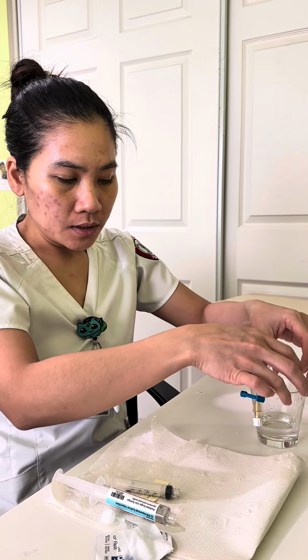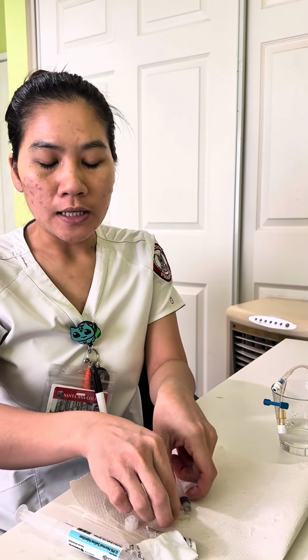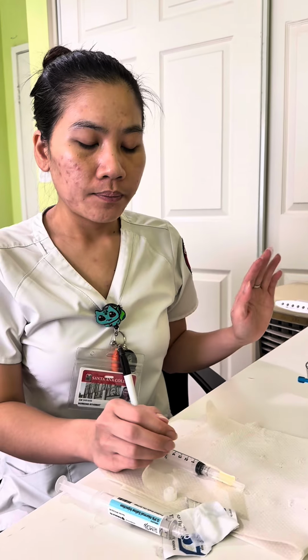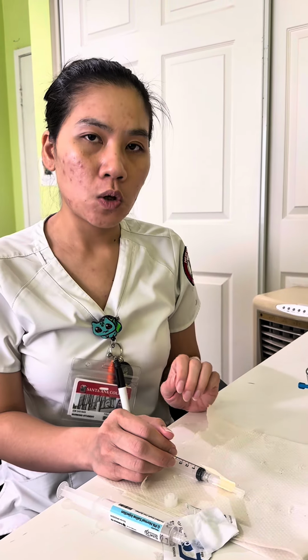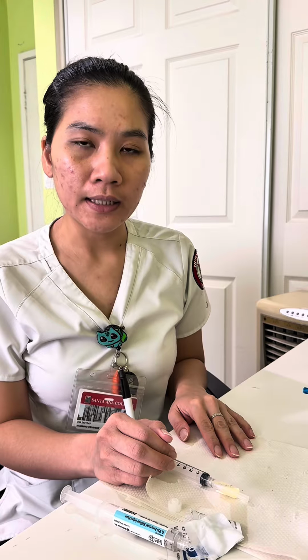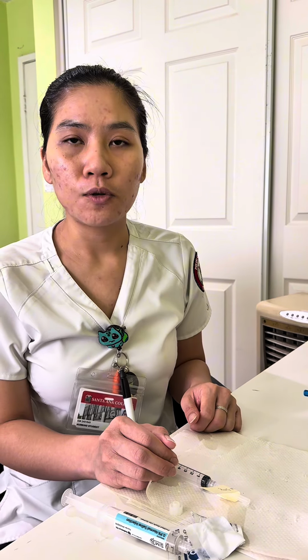I'm going to empty the tube into the sharps container, and then document the procedure I just did: the medication I gave, the dose and the time, the site, the IV I used to administer the medication, and also how the patient tolerated the procedure.